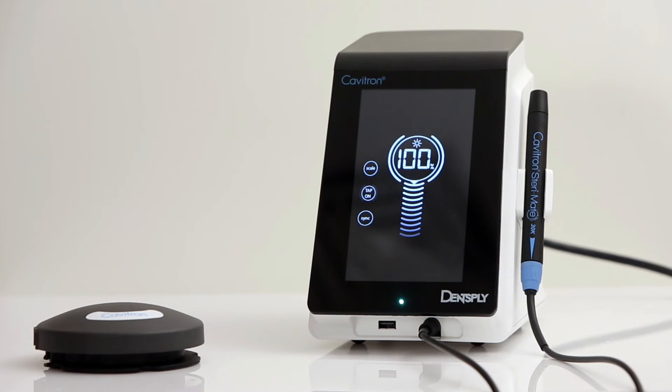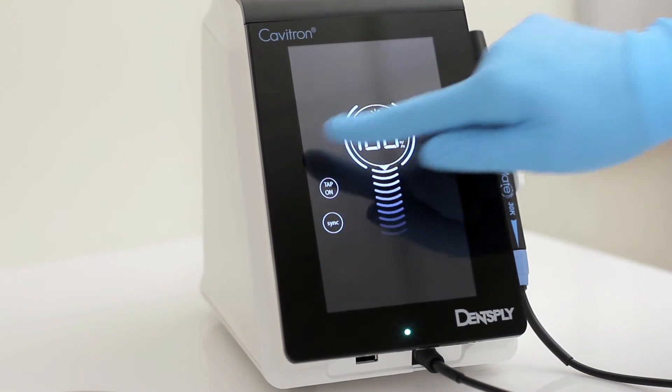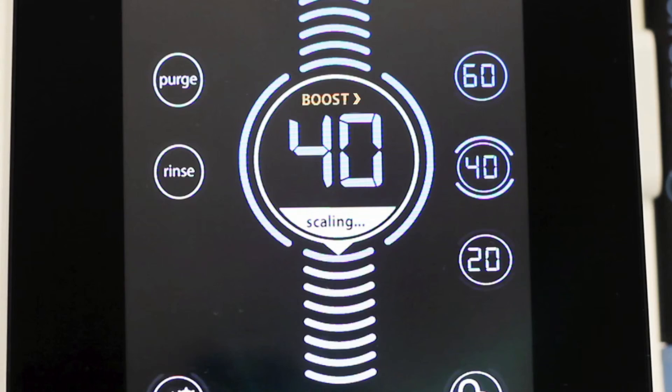In order to verify that there is proper communication, press the scale icon to return to the main screen. Press the foot pedal to the second position and ensure the boost is activated.